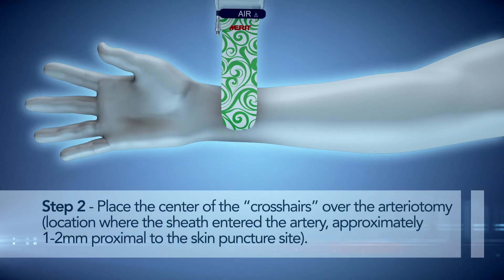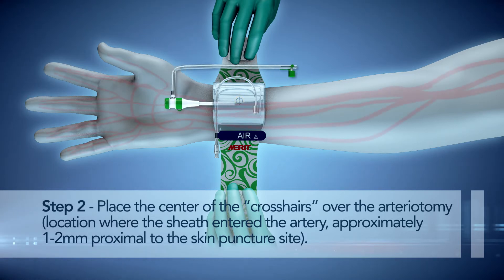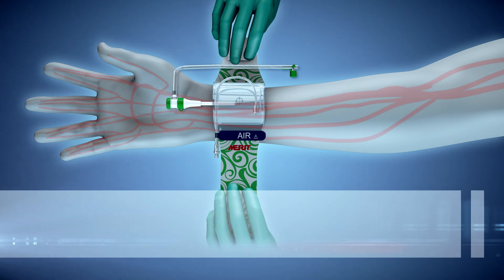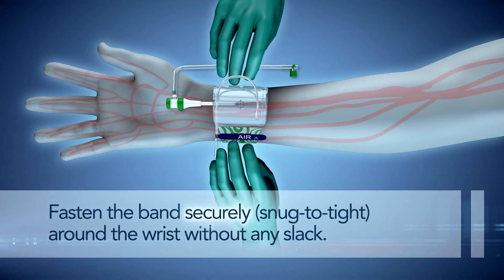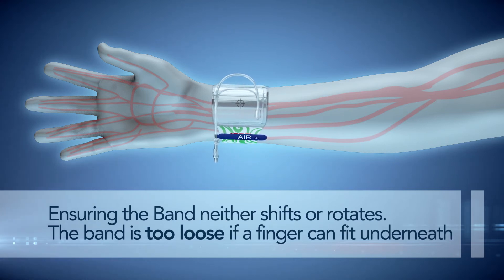Step 2. Place the center of the crosshairs over the arteriotomy — the location where the sheath enters the artery — approximately 1-2 mm proximal to the skin puncture site. Fasten the band securely around the wrist without any slack, ensuring the band neither shifts nor rotates.